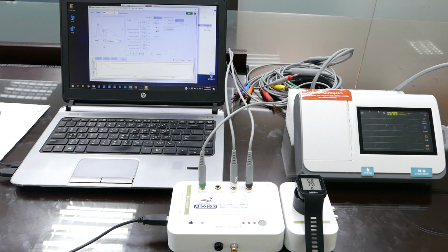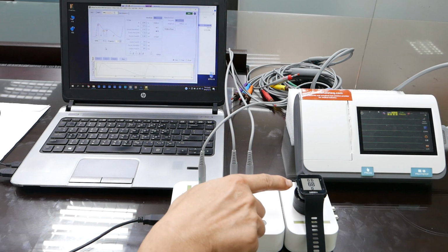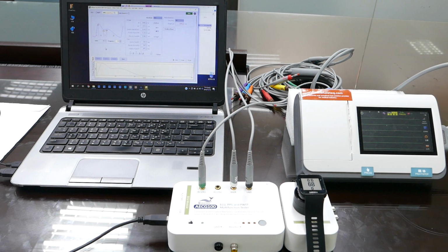The required time depends on the algorithm of the DUT. The more PPG signals the DUT detects, the higher its accuracy. For this DUT, it takes about 10 seconds, and the displayed heart rate matches the value set in AECG100.